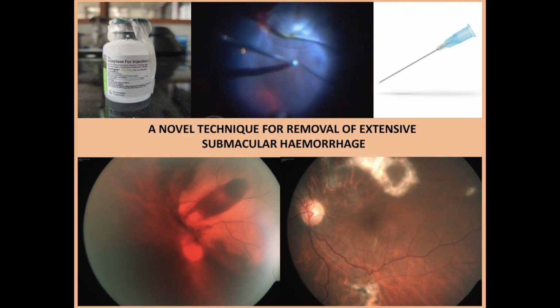Everyone, on behalf of Anand Bajaj Retina Institute of LV Prasad Eye Institute, Hyderabad, we present to you a novel technique for removal of extensive submacular hemorrhage.